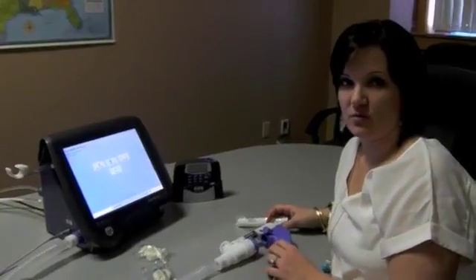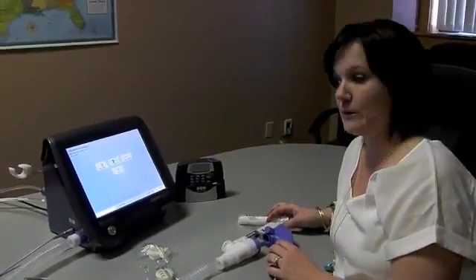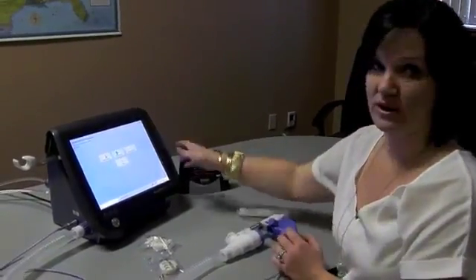Today we're going to be performing a nitrogen washout test on the EZ1 Pro lab. We're going to demonstrate how that's done.